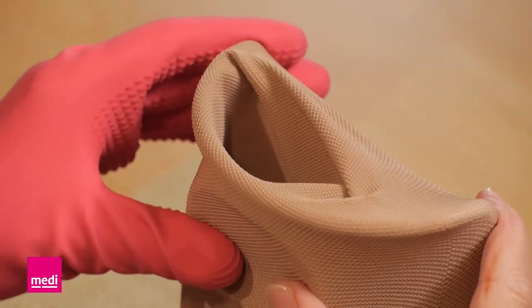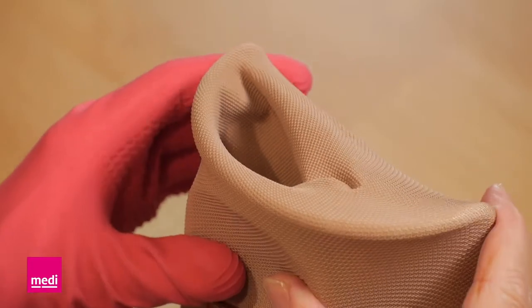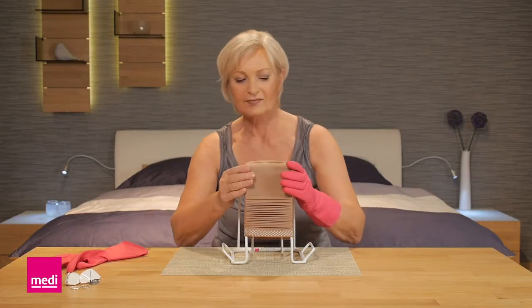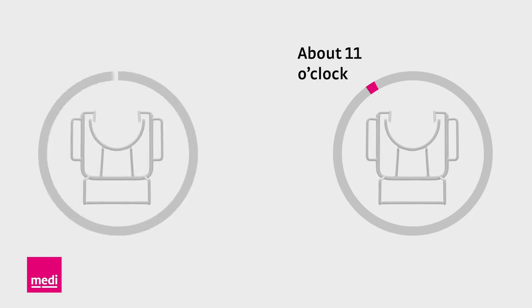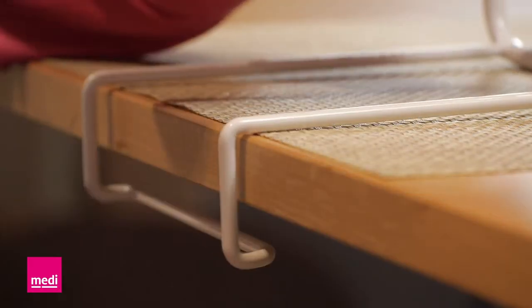Now slip the arm sleeve down over the semi-circular cylinder until you can see the arm sleeve's lower cuff. Make sure that the ellipse is facing slightly offset to the side, away from you. For an arm sleeve for the right arm, the ellipse faces upwards and to the left at about the 11 o'clock position. For an arm sleeve for the left arm, the ellipse faces upwards and to the right at about the 1 o'clock position.